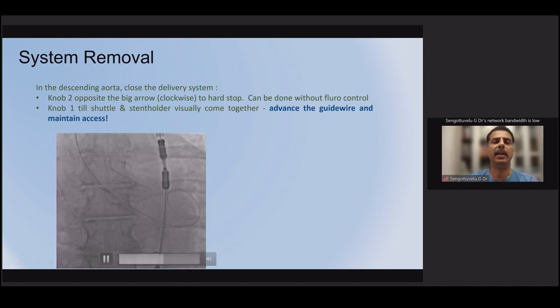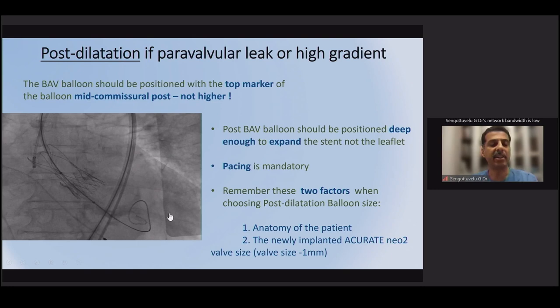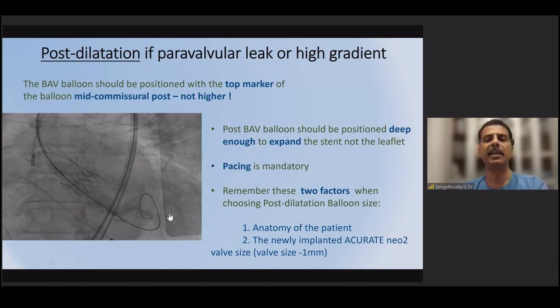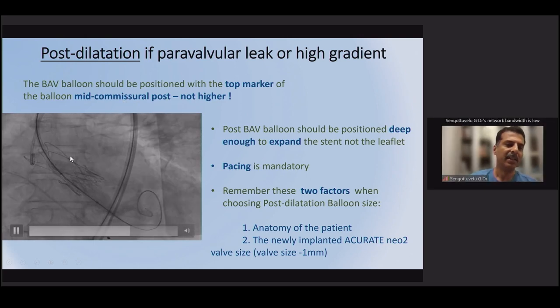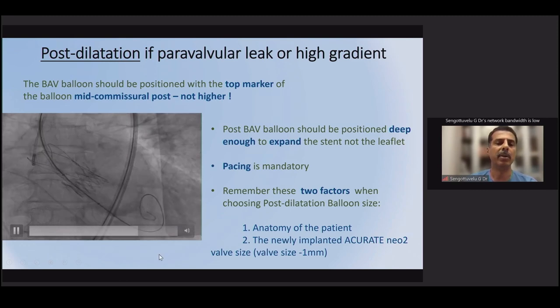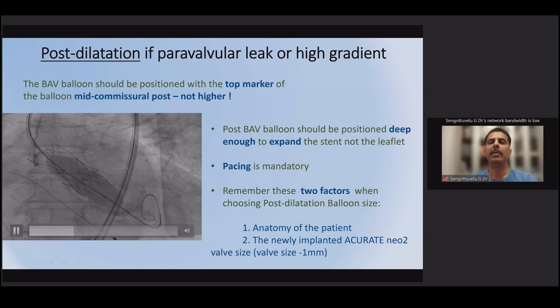After valve deployment, perform an aortogram with the pigtail kept above the stabilization arches, confirming wire position, and assess for paravalvular leak. If balloon post-dilatation is required, use the same balloon as pre-dilatation — do not upsize. The balloon should be less than 1 mm larger than the valve size. Position the balloon so the proximal marker is at the commissural tab level to avoid going too high, targeting only stent expansion. Maintain wire position and deliver post-dilatation.